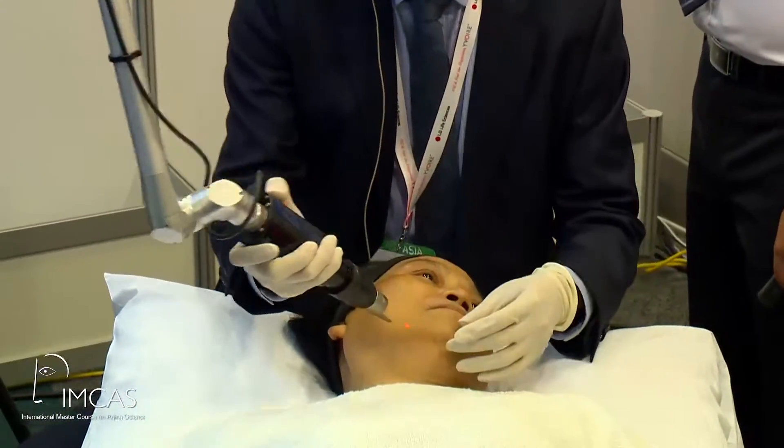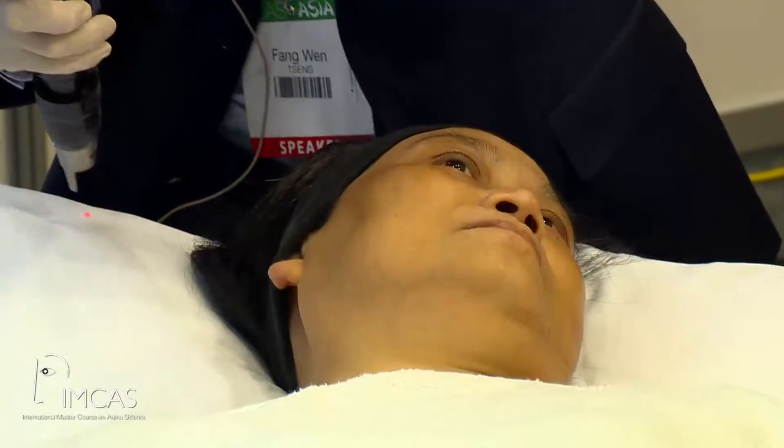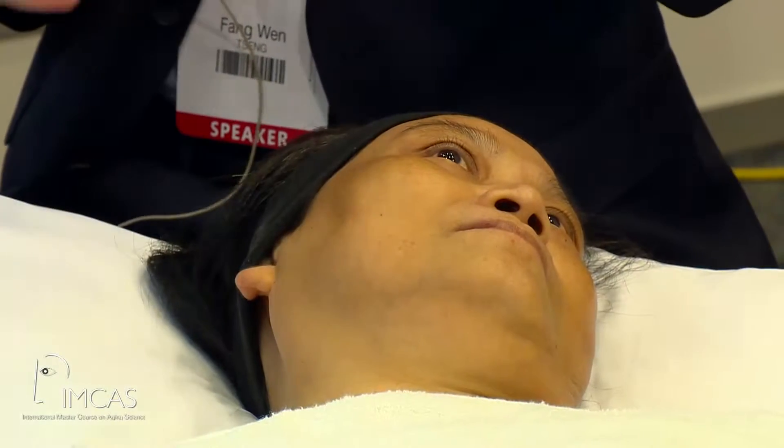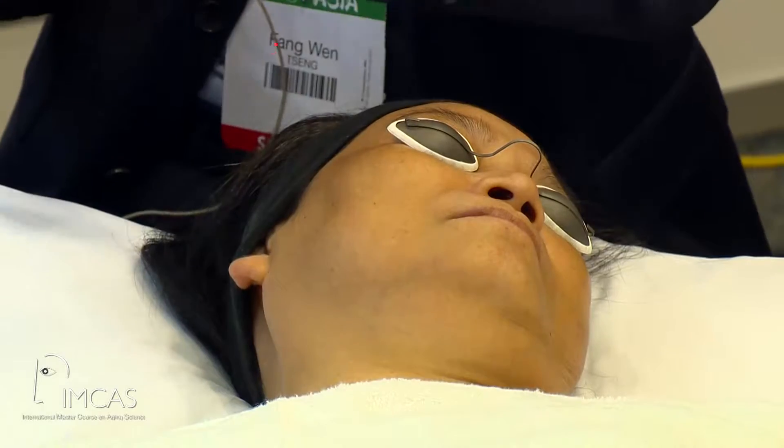Everybody got their glasses on? Okay, and I'll just start. You need to put on a goggle for the patient — goggles, please. Sometimes you get busy and forget. Goggles for patients, goggles for doctors, and goggles for staff. Thank you.